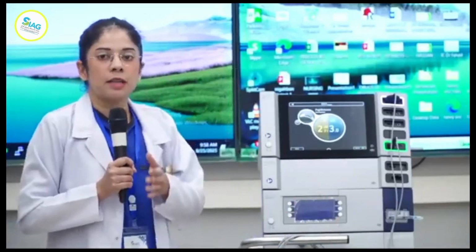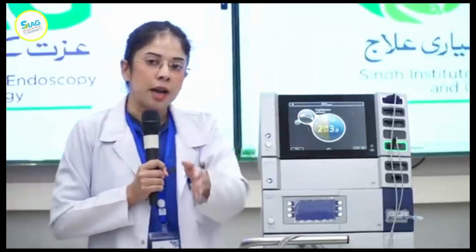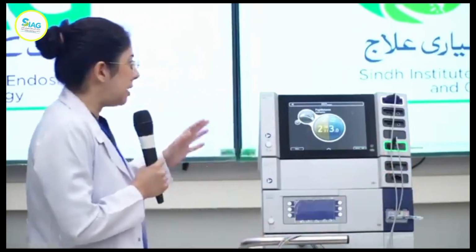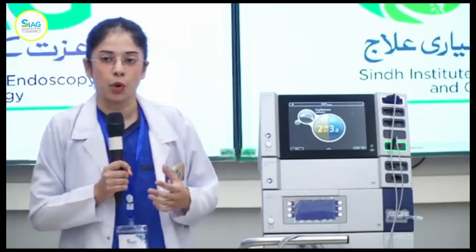Everything that we're trying to tell you is that it's not just that this is a burn and every burn is the same. It's actually dependent on the temperature. It's dependent on the exposure time. It's dependent on the resistance of what you're trying to burn. And this is what these settings are all about. If I'm wrong, do let me know at any point. This is something that I'm also learning as we're going.